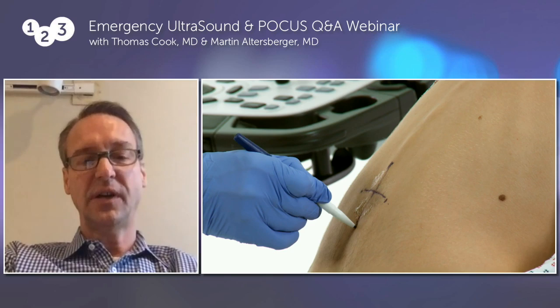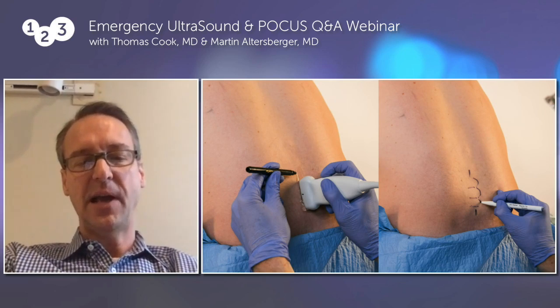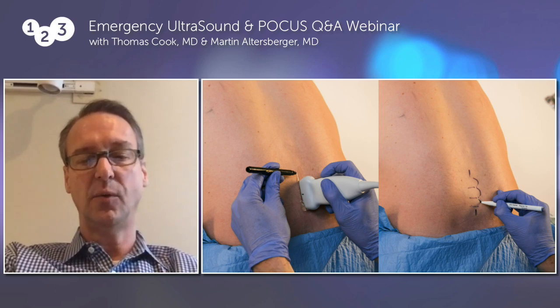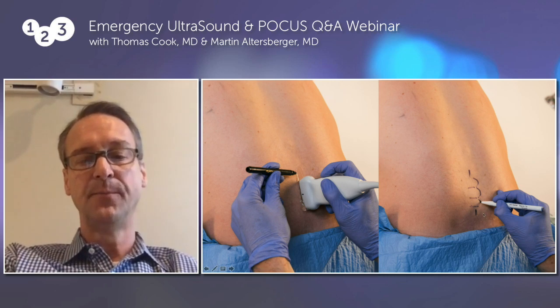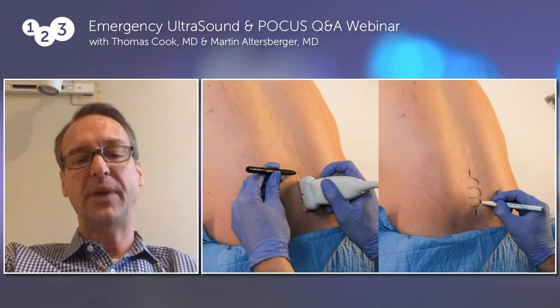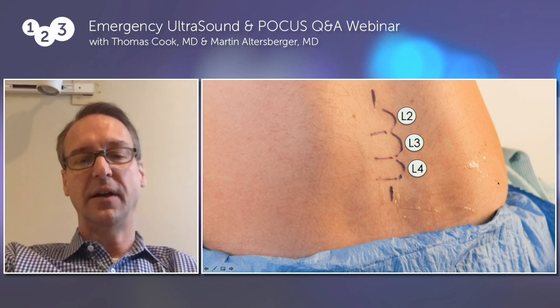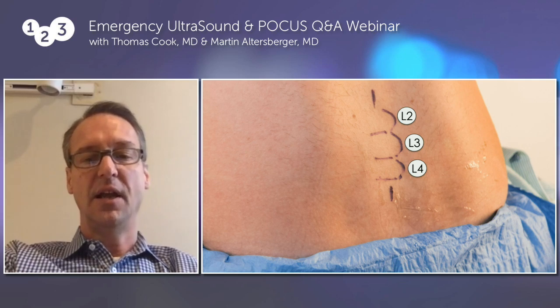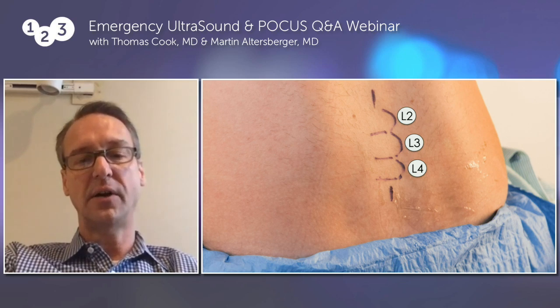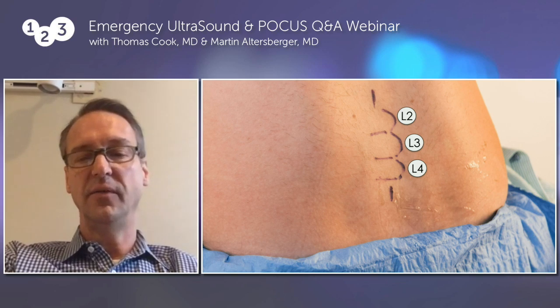Now there's obviously the tricks with a lot of these sorts of things, and I'll throw a few what we call pearls at you. One of those is how you mark the skin. You have to come up with a system that makes sense for you. This is basically the one I use, where I mark where the tips of the spinous processes are, sort of in a vertical alignment. And then I mark where the spaces are between the spinous processes with a horizontal line. And then I put a little curved line in there, and that tells me where each of the lumbar spinous processes are. So you can see that marked on this slide. And so what I'm going to do is place my needle at the horizontal line in line with the vertical line to do the procedure. And almost always you're able to get what you need done, even on very challenging patients.